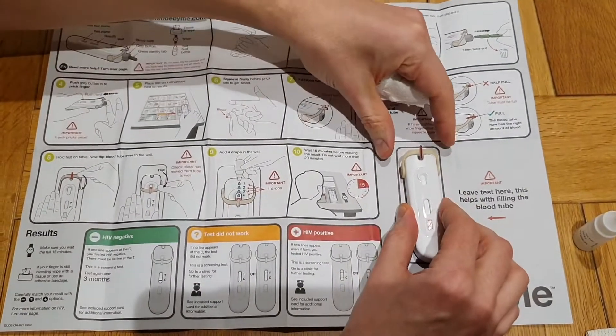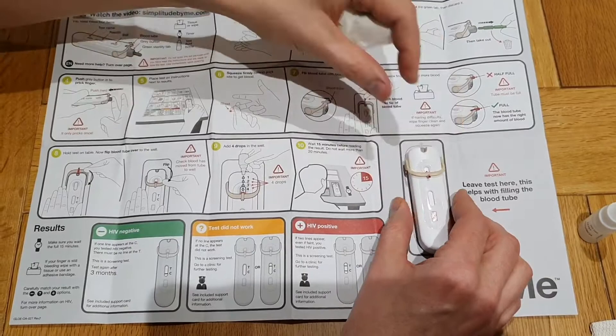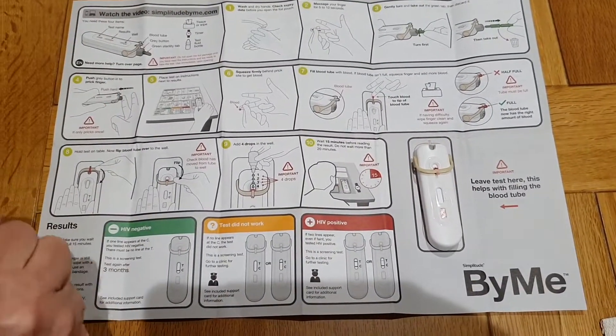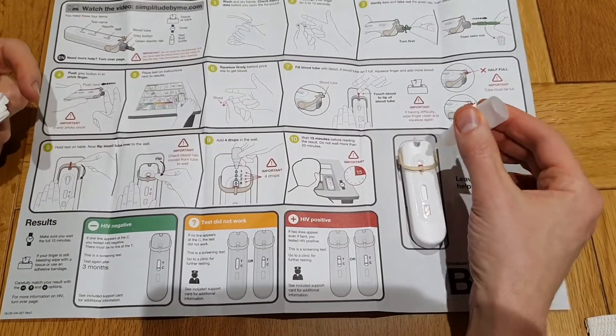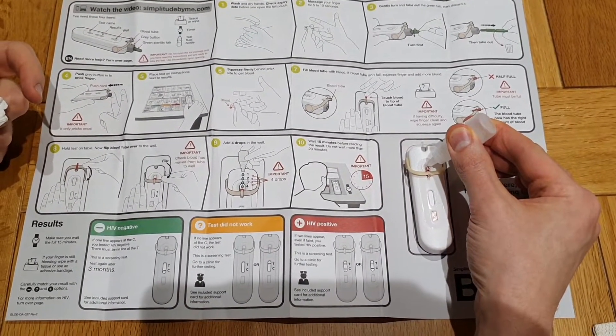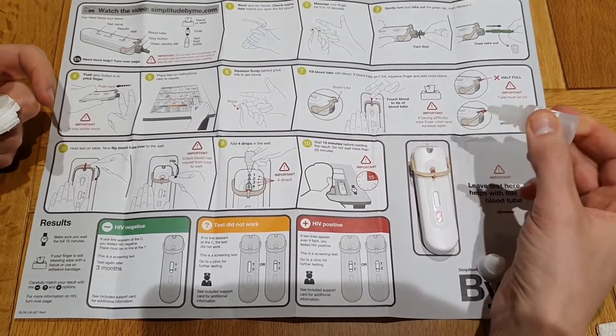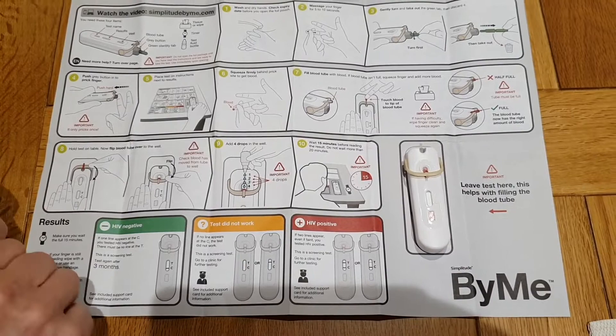We flip this over until you hear a click. I heard a click, and then get the solution — importantly, four drops: one, two, three, four. Okay, and we'll see you in 15 minutes.